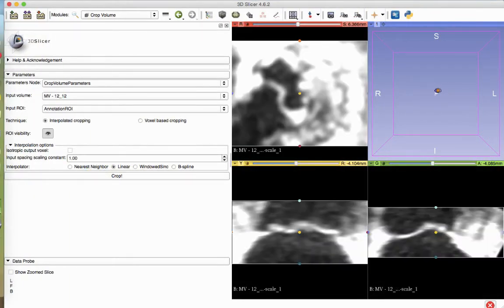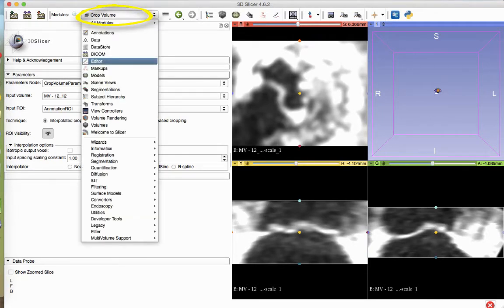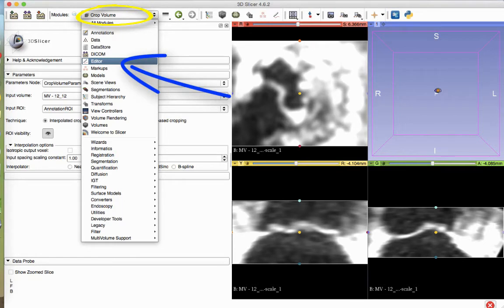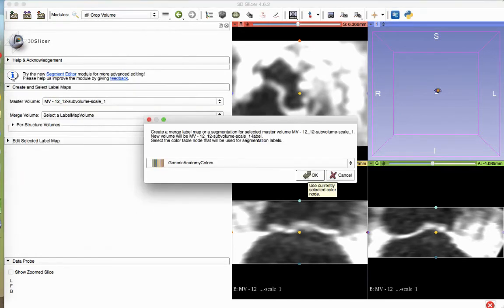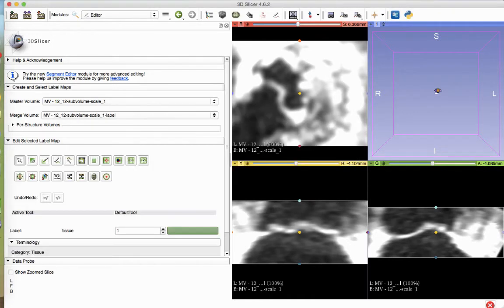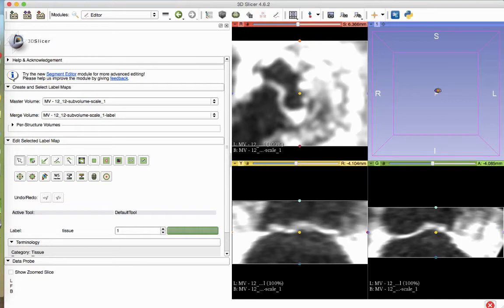After selecting Crop, enter the Editor module from the Modules drop-down menu. The master volume will now be called Subvolume Scale-1. This is the cropped volume. We are no longer working with the full volume. You may choose to save your cropped NRRD file at this time to eliminate steps for reprocessing purposes.